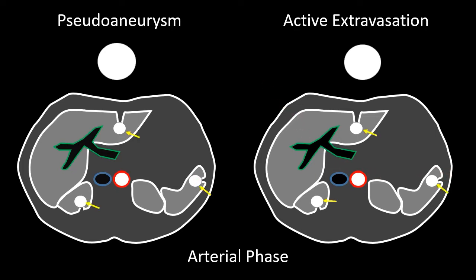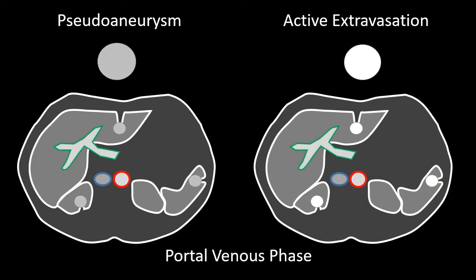As we move into the portal venous phase, the density of the pseudoaneurysm is going to remain similar to that of the aorta, because this is still within what we call the blood pool. Blood is flowing into and out of the pseudoaneurysm, and it is often related to an arterial vessel, so its density will often be similar to the aorta. So the density will decrease substantially to a similar degree that the aorta decreases. In the case of active extravasation, the density may not decrease to the same degree as the aorta, because it is not contained within a vascular space — the contrast begins to pool and does not wash out. So the density of active extravasation in the portal venous phase may be slightly greater than that of the aorta.